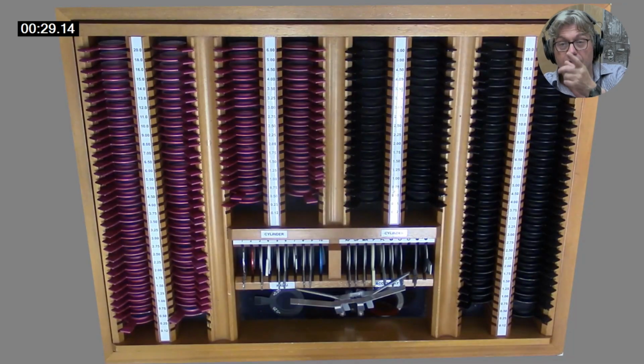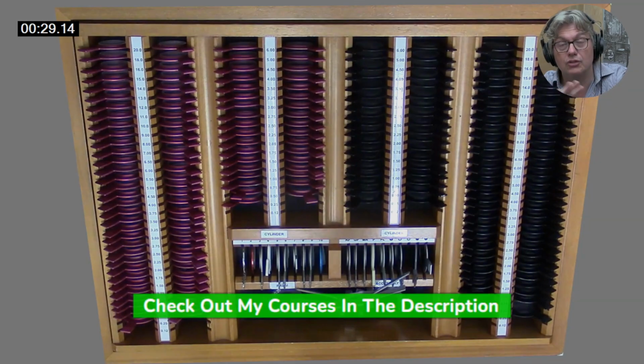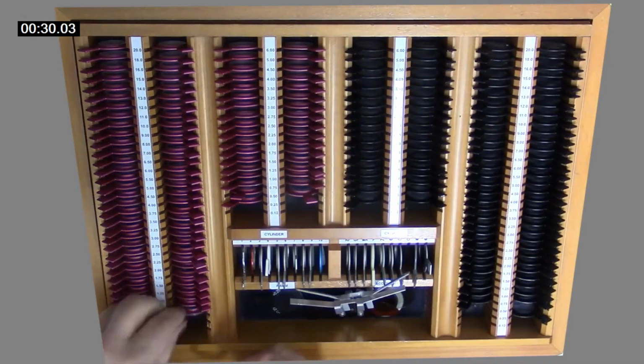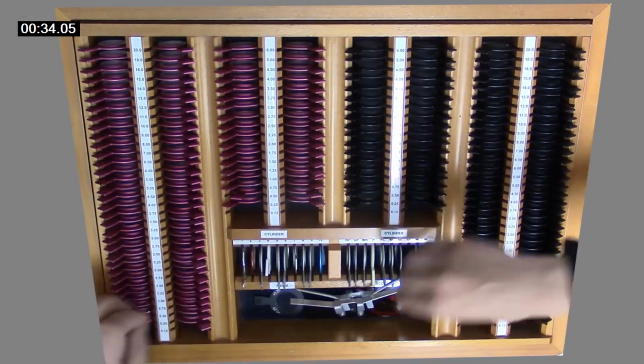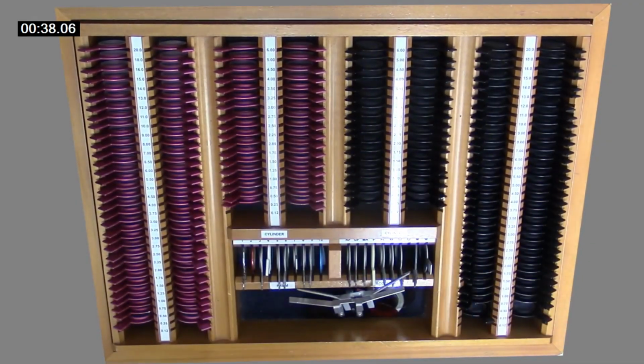Now this is really important. I know it seems very petty here, but whenever you refract you should always make sure all the lenses are in the right place, get all the cylinders lined up, everything all in its place. Then you know exactly where you are. You're going to get much better at it. So let's carry on, shall we? That's what you normally do before you start eye testing, try and make sure that they're all in the right place.